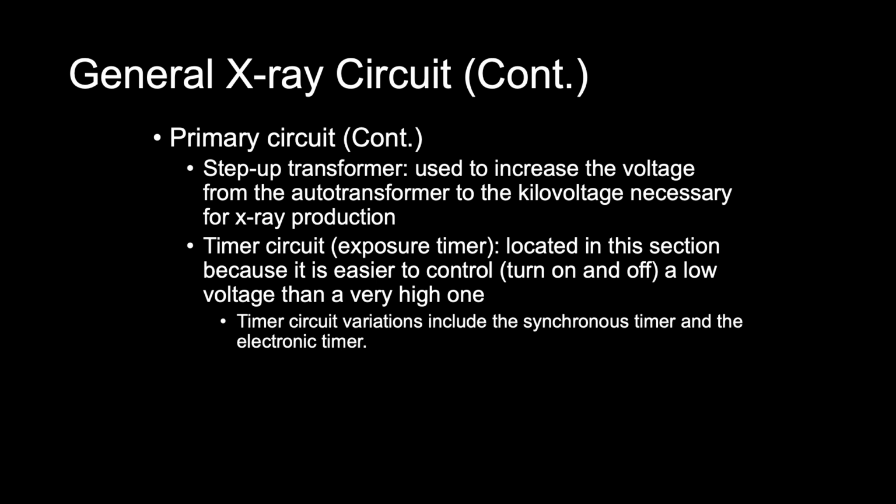To achieve a 1 millisecond exposure, there is virtually no resistance, and the capacitor charges very quickly, and the timer terminates the exposure. This is one application for a resistor in the X-ray circuit.